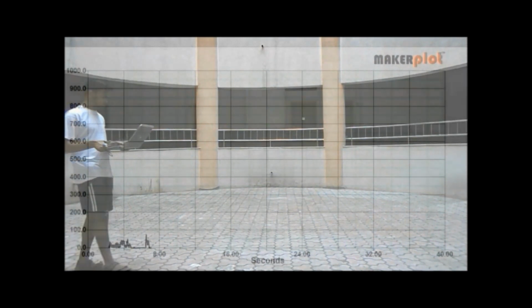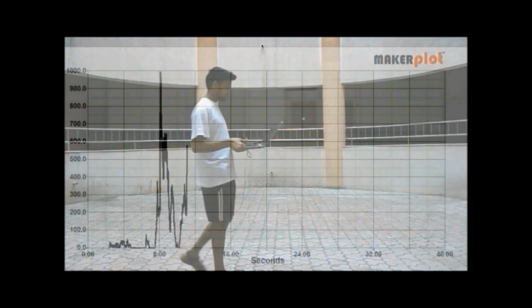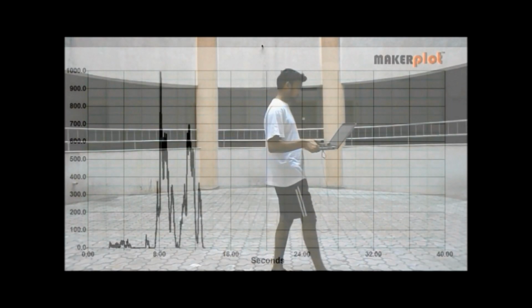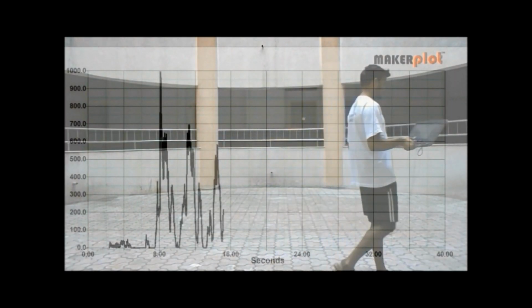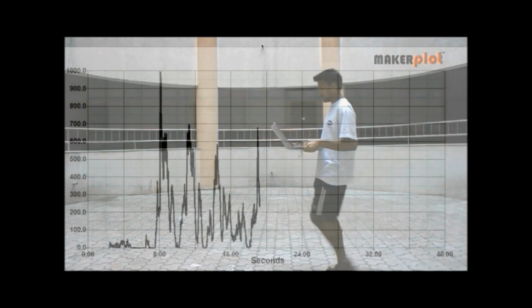This video shows the EMG signals acquired from the calf muscles of the right leg. The peaks in the values of the EMG signal represent the point when 70% of the weight is shifted on the right foot. The acquired EMG patterns are analyzed by the microcontroller, and when these peaks are detected by our algorithm, the knee joint of the prosthetic is actuated.